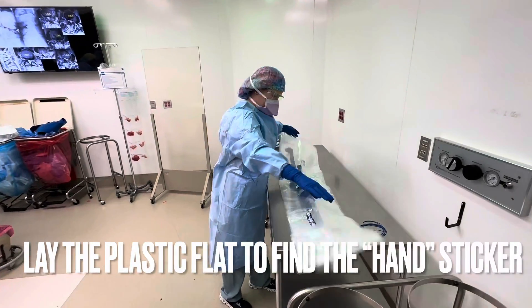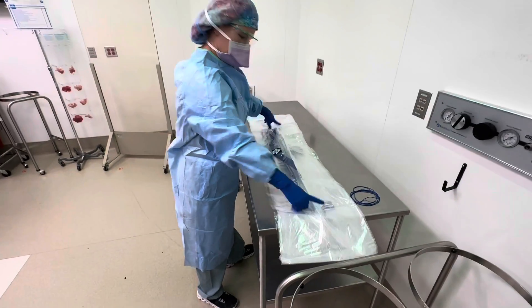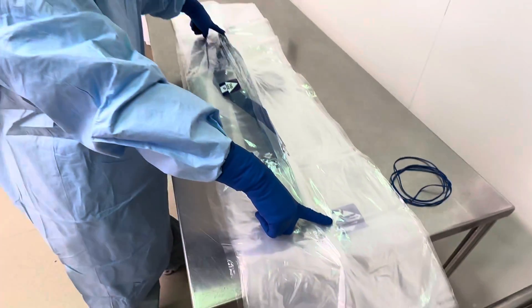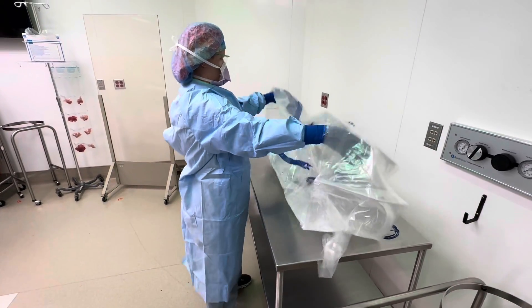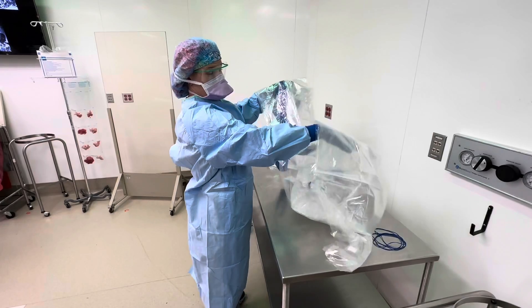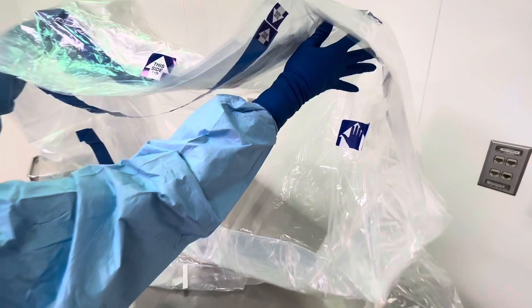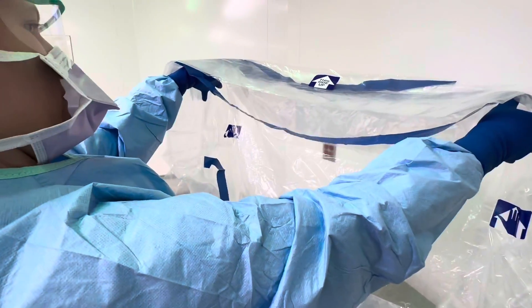You go over your drape and find the marking — find the hands. Then where do you put your hands? You gotta be right next to the hands on both sides.